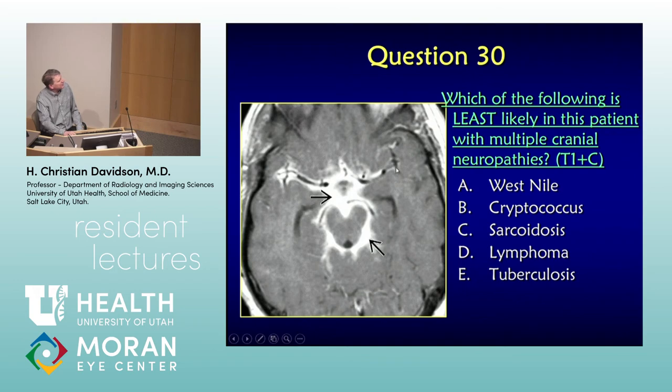Okay, so this is a T1 post-contrast. The abnormality is lots and lots of enhancement filling the cisternal spaces, perimesencephalic, interpeduncular, suprasellar, going out of the MCA cisterns, all kinds of enhancement filling up everything. This is a pattern that we would term, if you were to describe the generic pattern of involvement, what term would you use? Leptomeningeal. This is a leptomeningeal process of some kind. It's either leptomeningeal inflammation or it's leptomeningeal tumor.